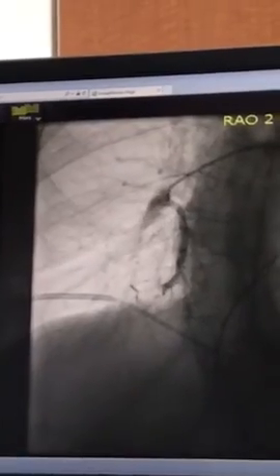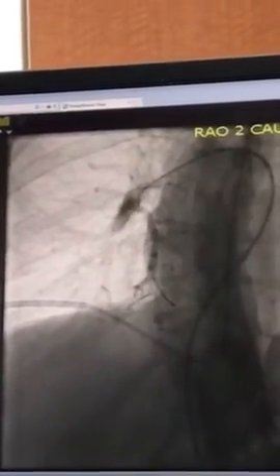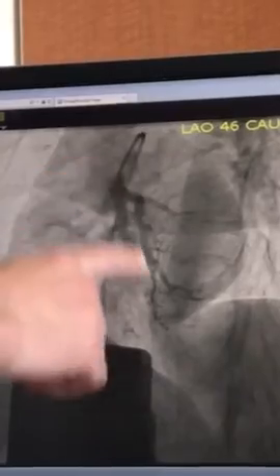Okay. This is another vessel that we hadn't treated beforehand. It's this high branch in the back part of the lower lobe of the lung, and again, sort of the wire is going down there. And there's the small balloon. And this is a more lateralized view of that same vessel, so you're seeing this.